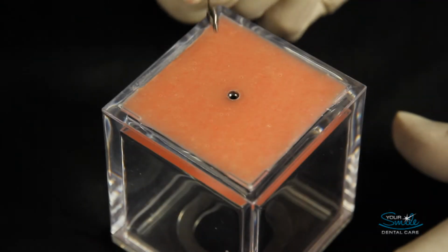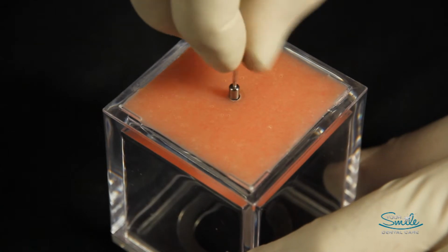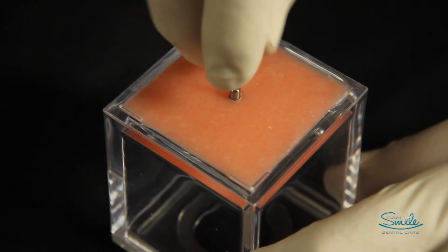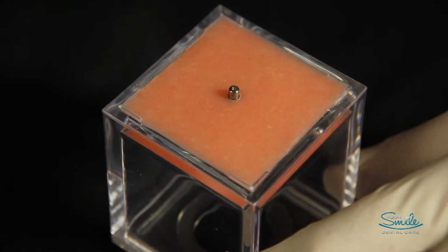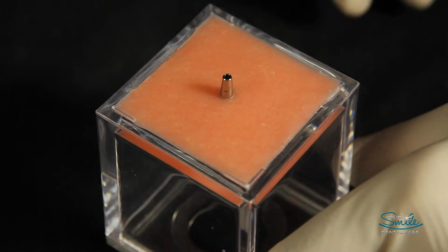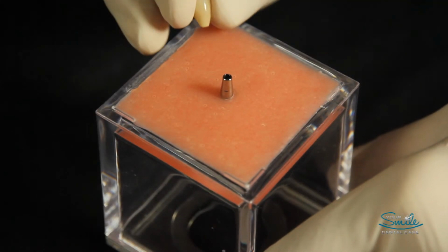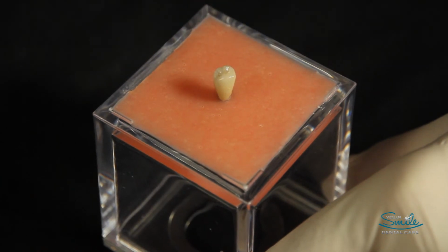There are times when it is best to avoid a second entry into the implant site a few months later. If the conditions are all right, we can skip the step of the cover screw at the first appointment and go directly to either a healing abutment and wait 2 weeks for the gum healing, or even directly to the final abutment and a temporary crown, and perhaps even impressions in the insertion of a final crown a week later.